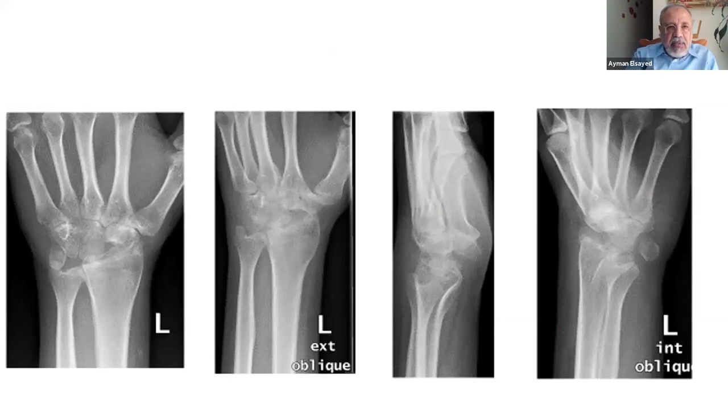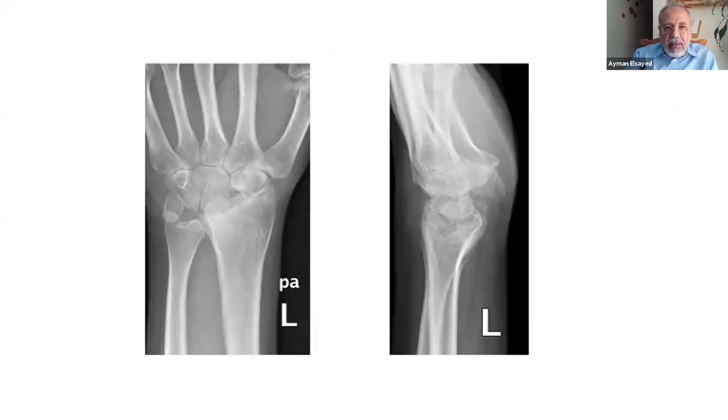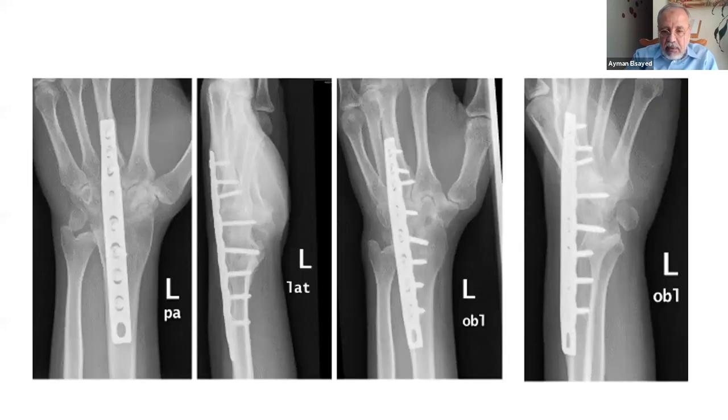But during the first follow-up, the patient had some pain which remained and increased and became intolerable. At 1 year, the pain was very much and he could not tolerate it, and he agreed to go for arthrodesis. And this is the final X-ray after consolidation of that arthrodesis.